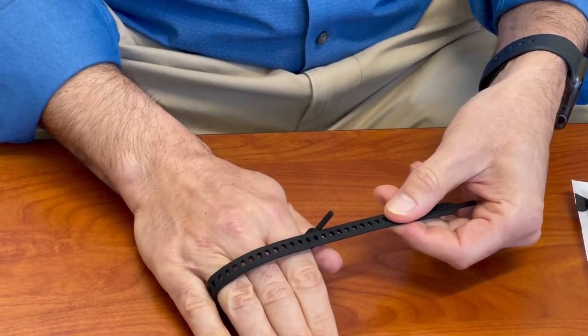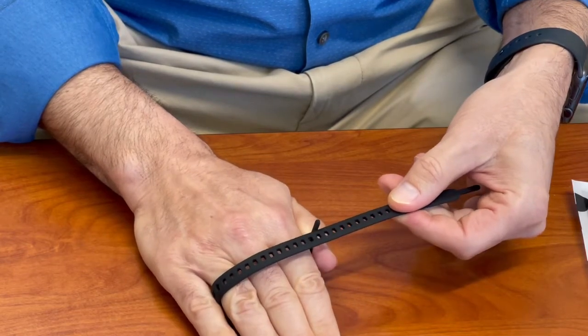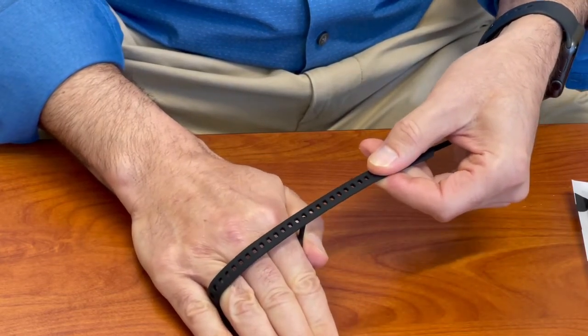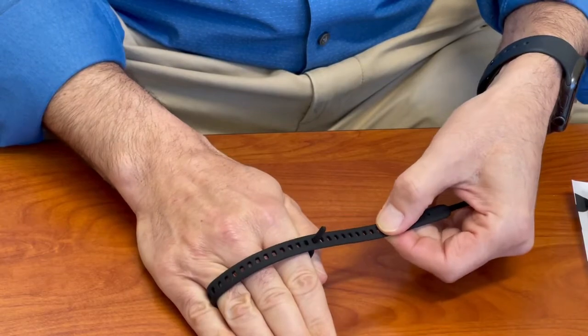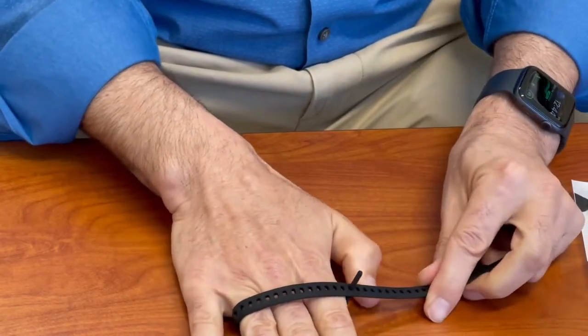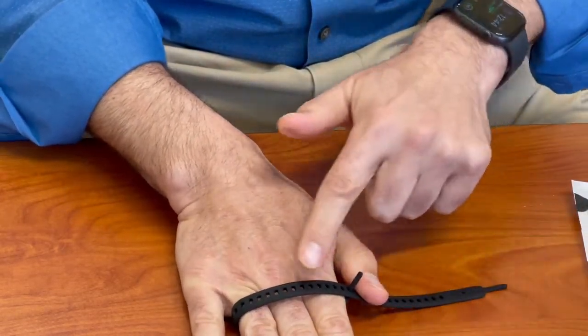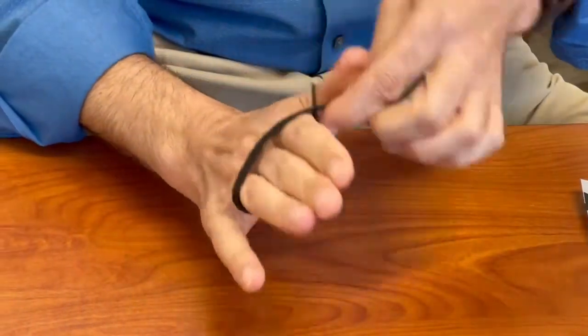This is the sizing portion of the application process and you just slide a tab through the perforation with a good fit around the fingers.